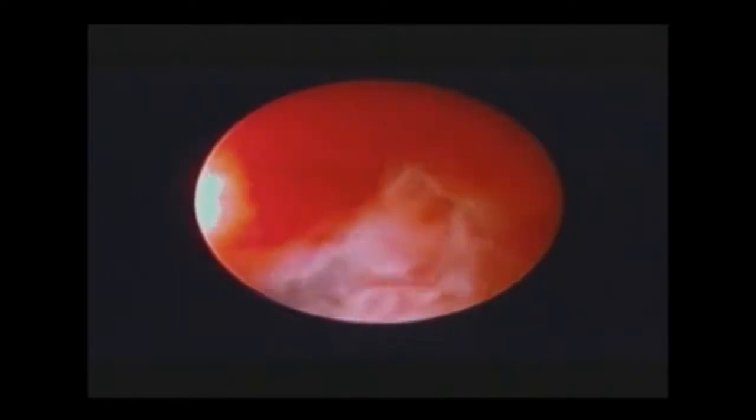If placed correctly, a bleb should be immediately visible through the cystoscope.